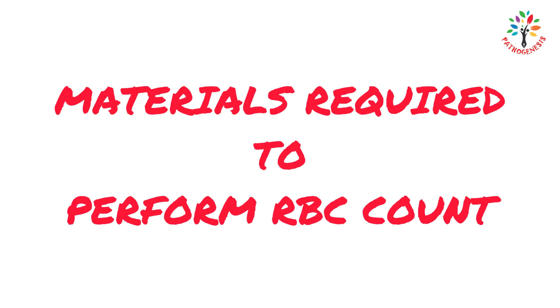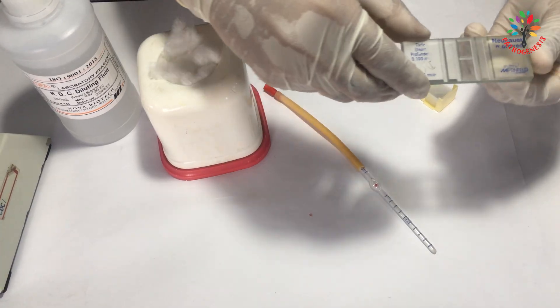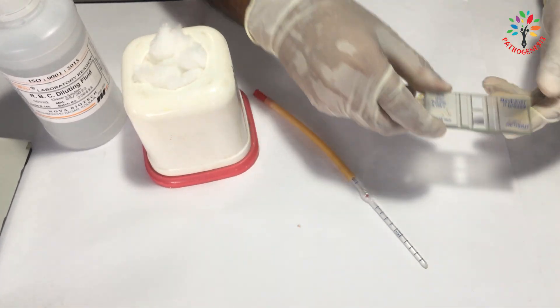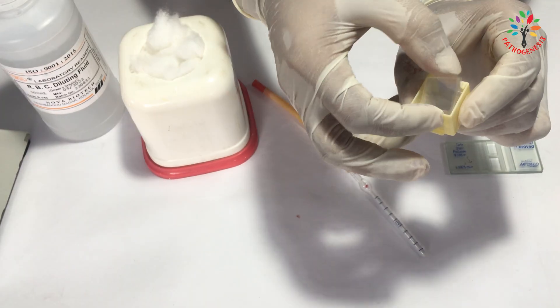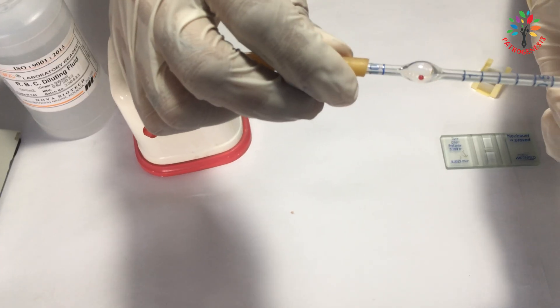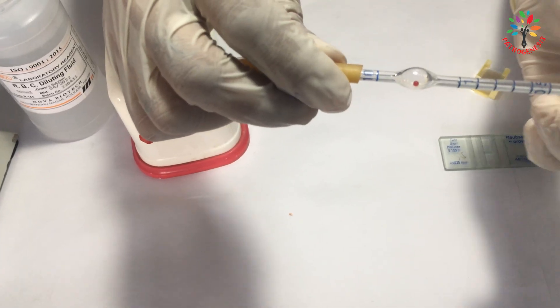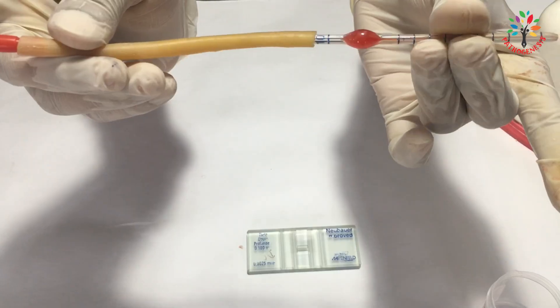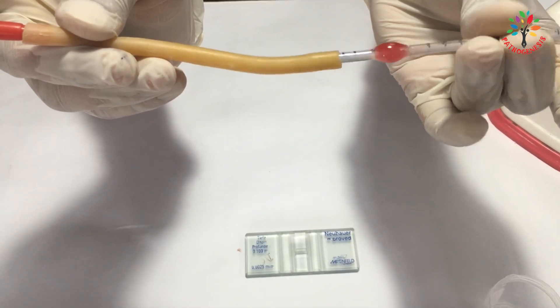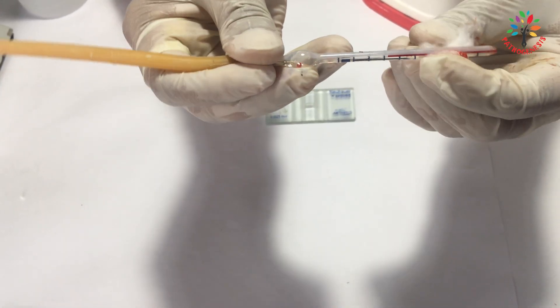Materials required to perform RBC count: We need Nuber's Chamber, also known as a haemocytometer, and a cover glass to place on top of the Nuber's Chamber. We need an RBC pipette which has 0.5, 1, and 101 marks on it. The RBC pipette has one red color ball within the bulb that helps to mix the blood sample with the diluting fluid. We need cotton to wipe the outside of the RBC pipette to remove excess blood.